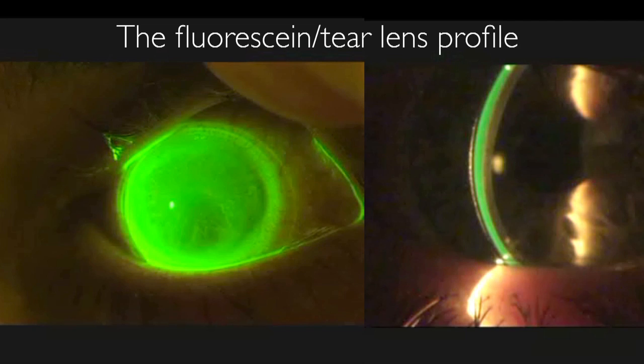So as we look at this eye with an optic section, what we want to do is maintain a very sharp focus. If you look carefully to the furthest left on that selection, you'll see the light shining off of the front surface of the lens. Underneath that is a very thin black ribbon of plastic. That is the material of the lens. Then you have that green zone, that's the fluorescein within the tears, and behind that, your grayish zone is your actual cornea.